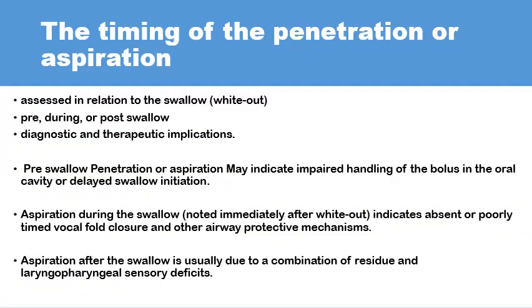The other important factor in the management of aspiration would be the timing of the penetration or aspiration in relation to the pharyngeal swallow, the whiteouts, whether it is before, during, or after pharyngeal swallowing.